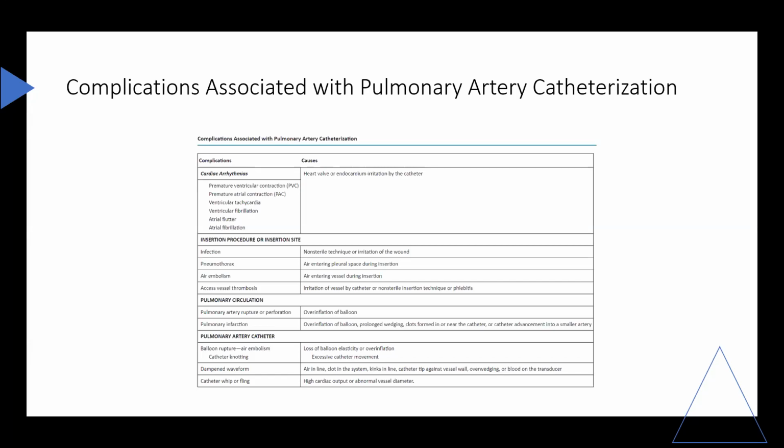This table lists the most common complications associated with right heart catheterization using a balloon-tipped flow-directed catheter. Ventricular arrhythmias are fairly common during catheter insertion and often are self-limiting. Electrolyte disturbances, hypoxemia, and acidosis increase the risk of developing ventricular ectopy. Careful monitoring of the patient's electrocardiogram during catheter placement can alert the clinician of the development of arrhythmias and reduce chances of provoking a potentially lethal complication such as ventricular tachycardia and fibrillation.